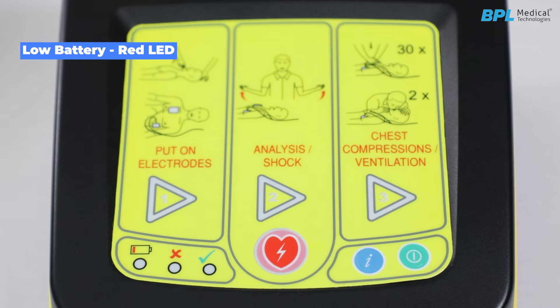Low battery status. Workflow triangle 1 is illuminated when the device is in the put-on-electrode stage. Workflow triangle 2 is illuminated when the device is in the analysis or shock stage. Workflow triangle 3 is illuminated when the device is in the chest compression or ventilation stage.